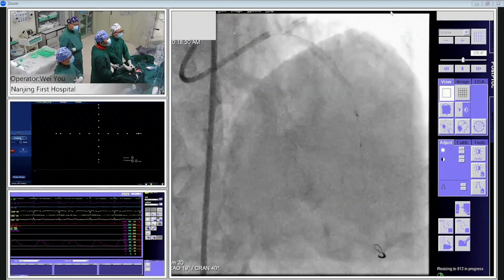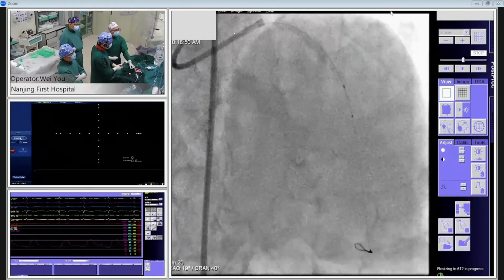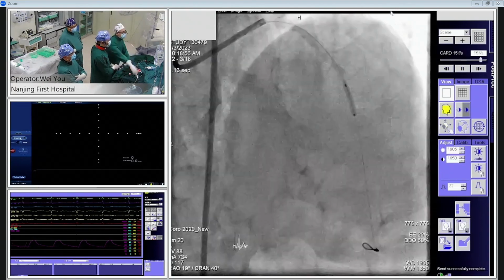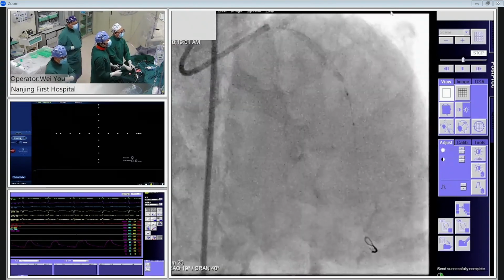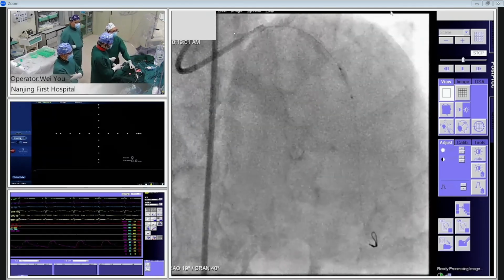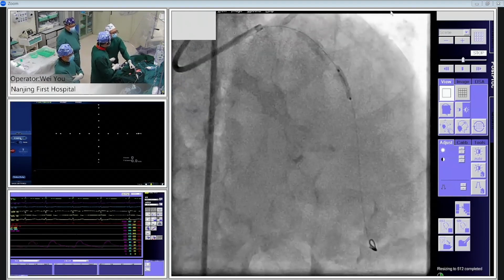Okay. So this segment is just balloon dilatable. We just use the nominal pressure. It's a 2.5 NC balloon. What's the balloon size? 2.5 by 15. Nice. Going up to 12. Prepare some GTN after balloon dilation. Okay. We will check the IVUS.